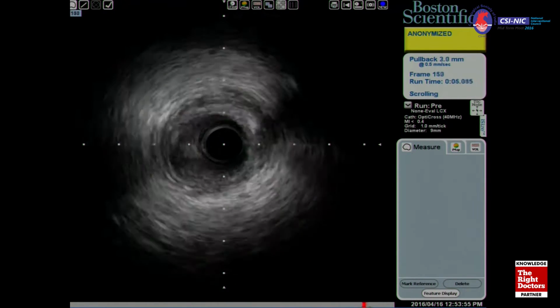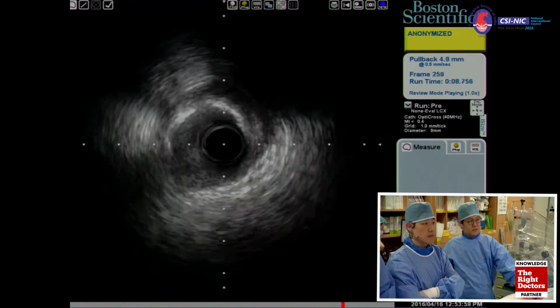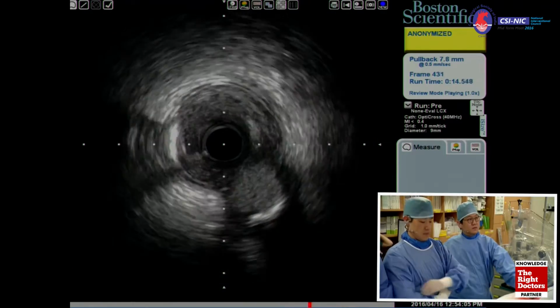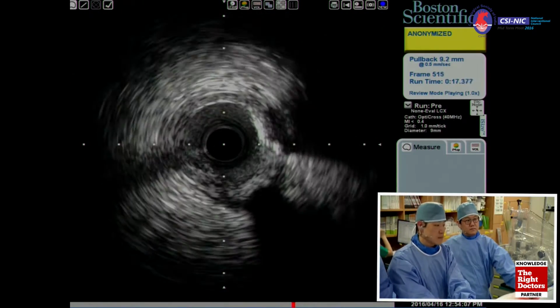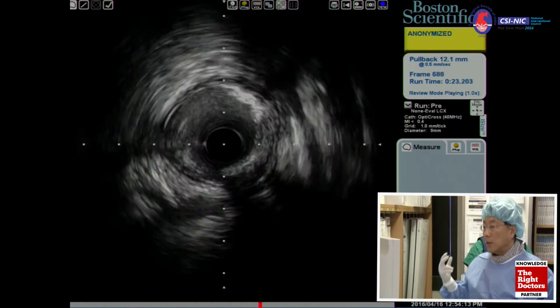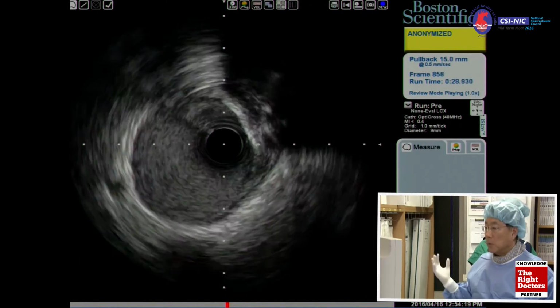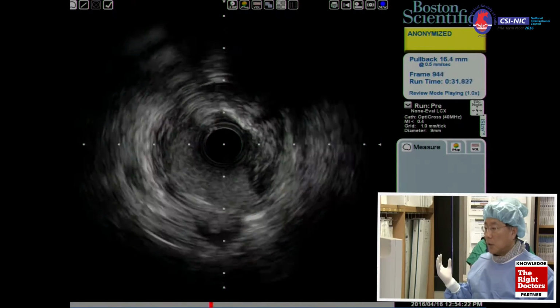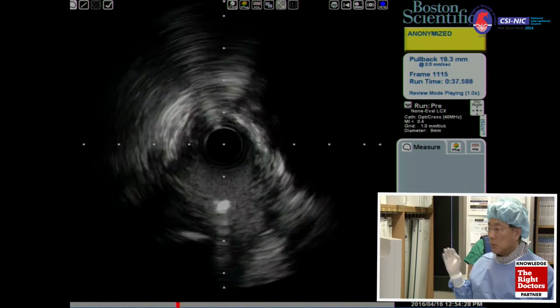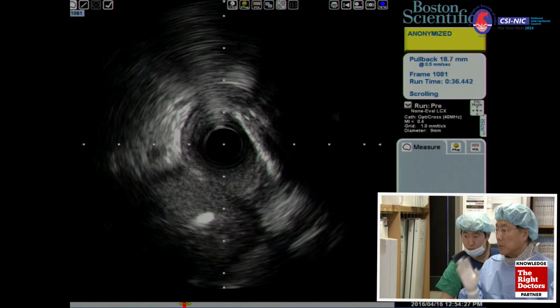Start from the OM distal. Yes, start. 3.0. Minimal plaque has some superficial calcium, and small branches from 5 o'clock. Superficial calcium still. However, the vessel is 3.0 and more than that, a big vessel with eccentric plaque, getting bigger. Small branches at 6 o'clock, lots of plaque. All right, 3.0, stop. Go back one or two frames. Okay, perfect, that one.